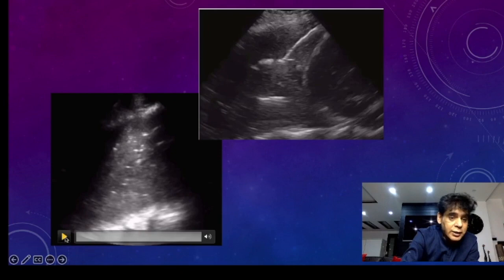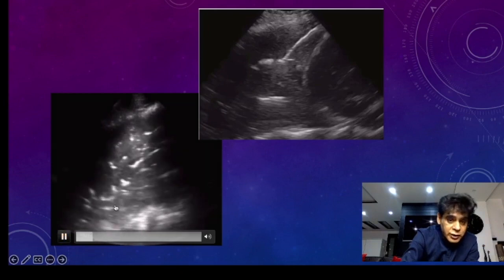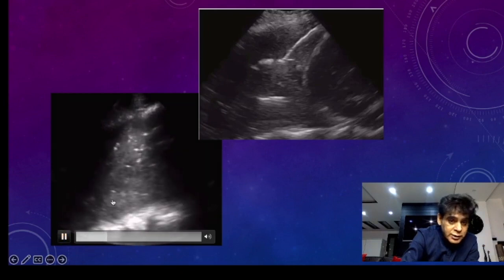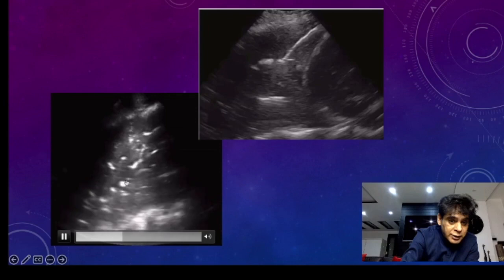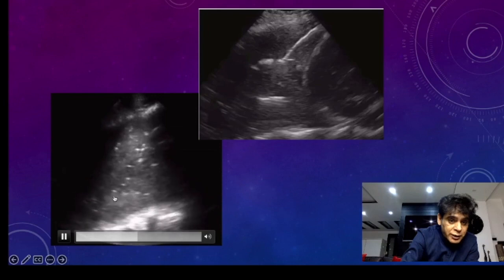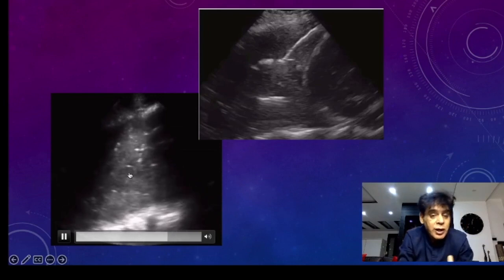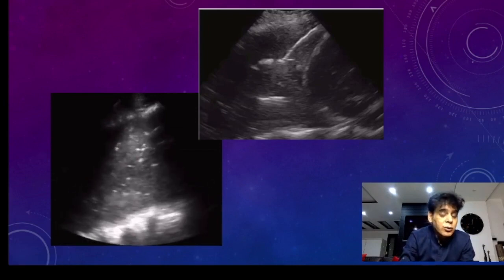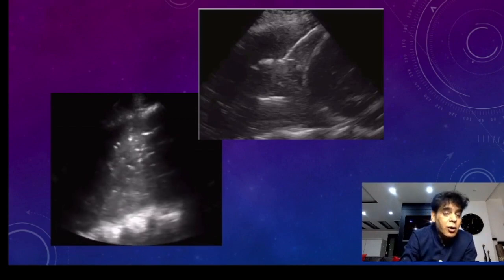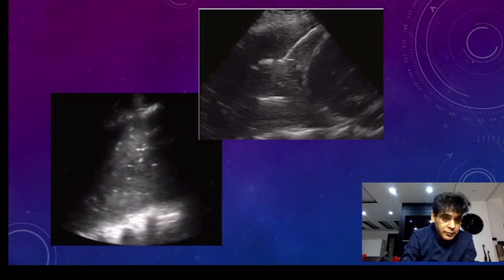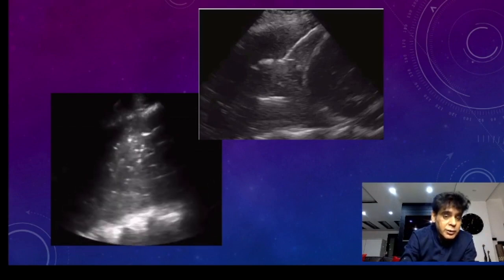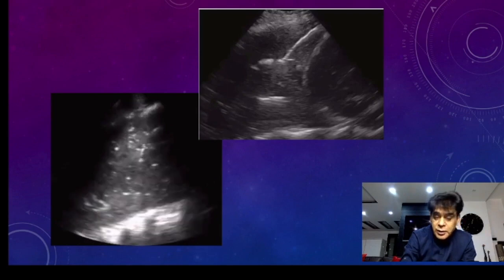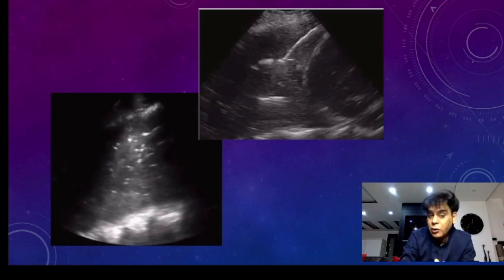Let us see the dynamic part with respiration. With respiration, you can see these air particles are moving up and down. The fact that they are moving up and down means there is no proximal airway obstruction, which means this is a case of consolidation and not collapse.